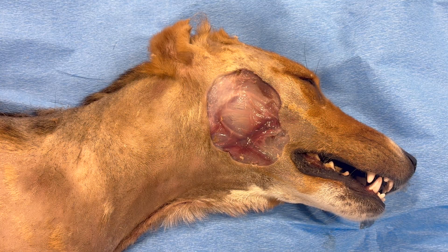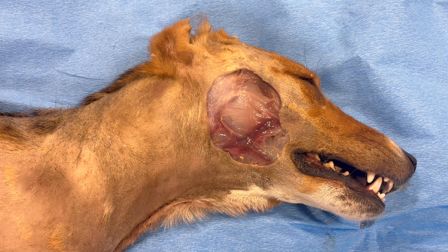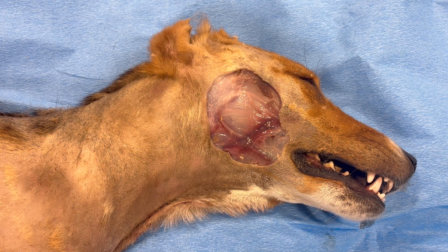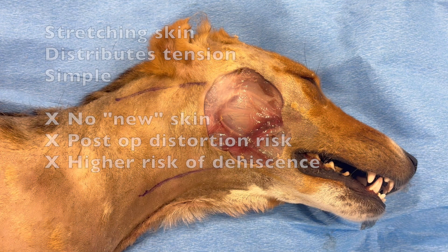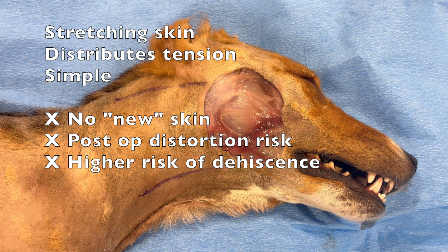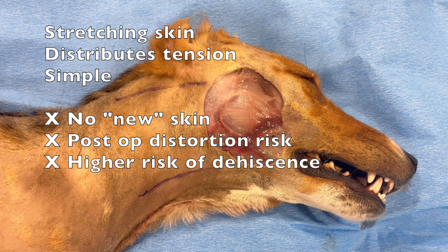With the single pedicle advancement flap, we're going to mobilize the skin about the neck and essentially stretch it. The single pedicle advancement flap relies on stretching of the local skin and it works by distributing the tension across a broader length of closure.